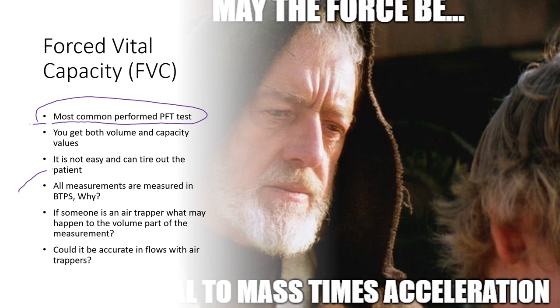All the measurements that we do with pulmonary function are measured in BTPS. Why is that? When you're exhaling, it's going to be at body temperature, pressure saturated. What does that have to do with anything, you may ask? Well, if it's at body temperature, pressure saturated, that can affect the volumes, right? And it can affect the way that it's read out compared to standard temperature, pressure, dry. Hopefully you remember this from your science class, STPD versus BTPS. That can affect our volumes and capacities. So that's why everything that we do is calibrated to BTPS, body temperature, pressure saturated. And I'll put a link in your Blackboard about this.